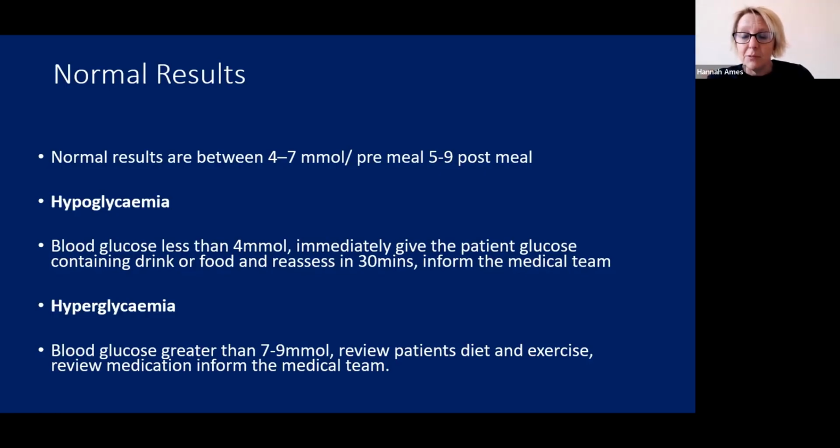So that is really important, because we do need to verbalise these action steps in our OSCE if we have a raised blood glucose level. So we're not just doing the skill, we're thinking about that nursing assessment, evaluation, and that next plan in terms of interventions that we need to do.